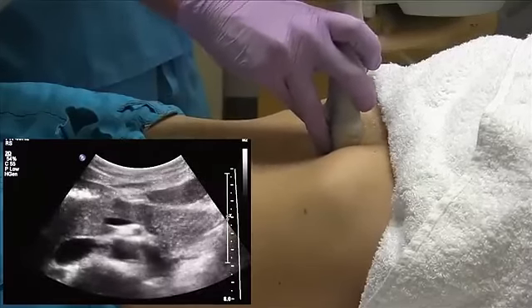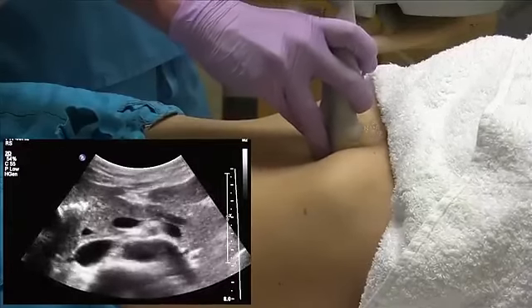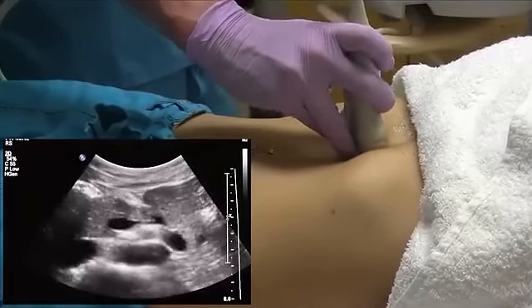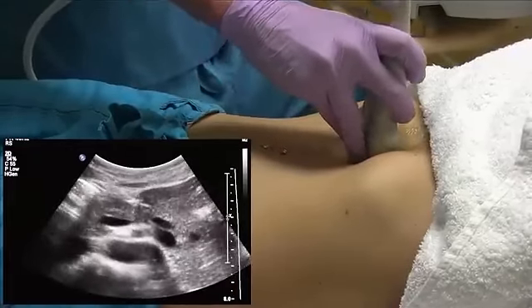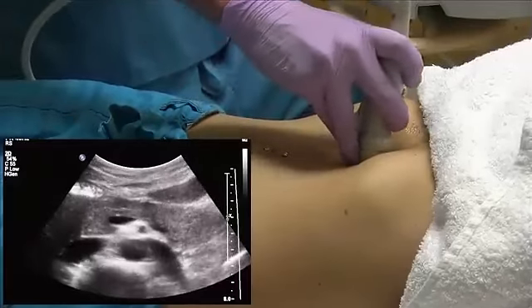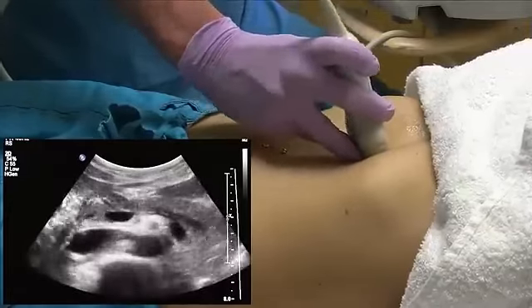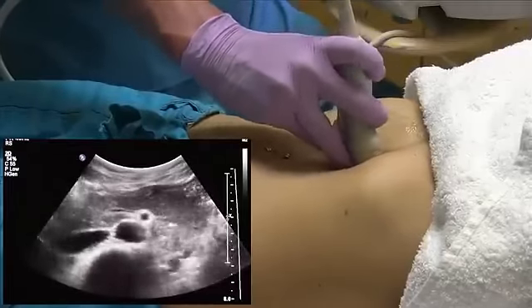If you look on this image here, the splenic vein is a good landmark to let you know that you are very close to, if not exactly on, your pancreas. And like every organ, you need to sweep through. If you just see the splenic vein and you take pictures here, you can miss other pathology in the pancreas.